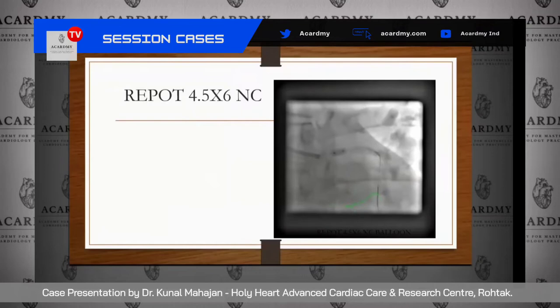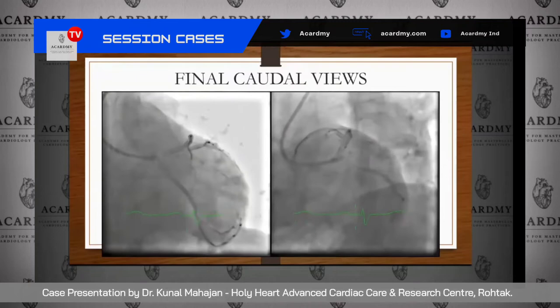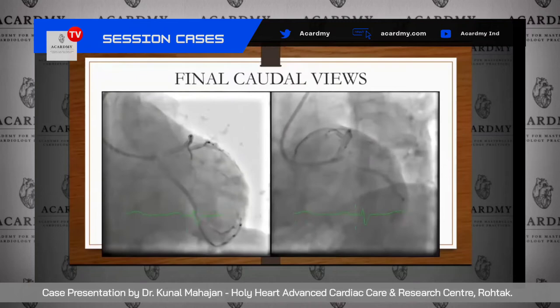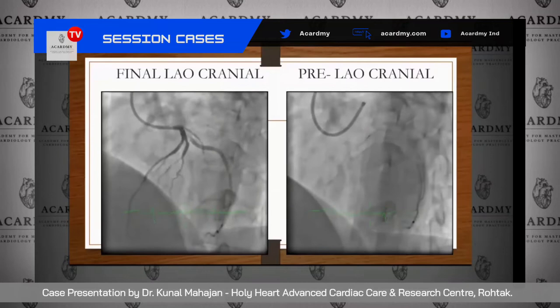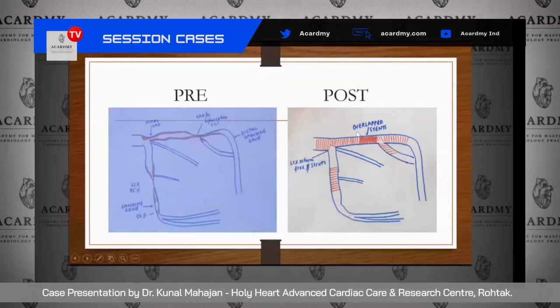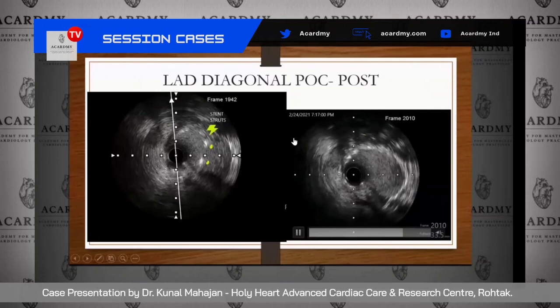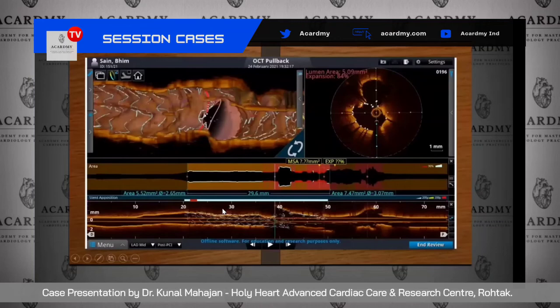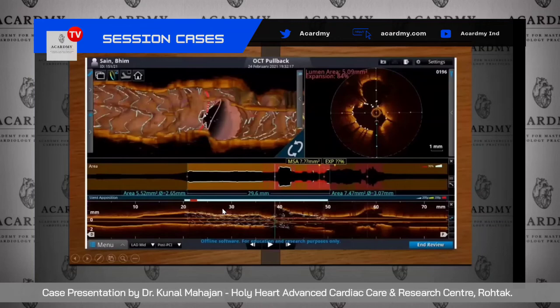Final POT was done with a 4.5×6 mm NC balloon. The final caudal and LAO cranial views showed a good result across both bifurcations. Comparing the final LAO cranial view with the pre-PCI view confirmed an excellent result. The pictorial diagram showed the only unplanned issue was overlapping stents in the mid-LAD, which we could have avoided had we not suffered the diagonal complication. On IVUS, the LAD-diagonal POC figure was 8, with very well-expanded stents. OCT confirmed very good neo-carina formation.